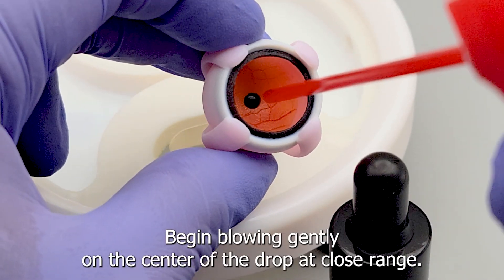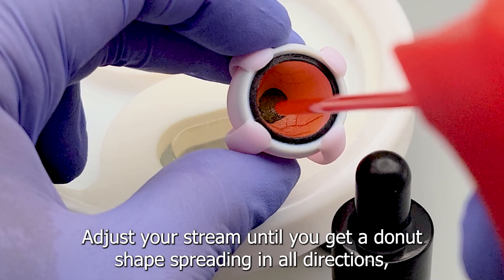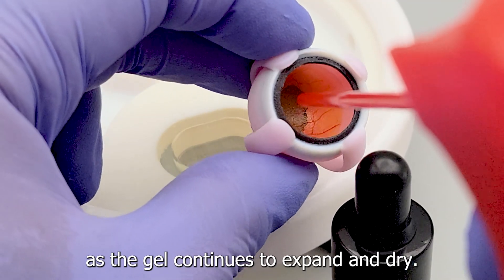Begin blowing gently on the center of the drop at close range. Adjust your stream until you get a doughnut shape spreading in all directions, and then gradually increase the air stream and pull away as the gel continues to expand and dry.